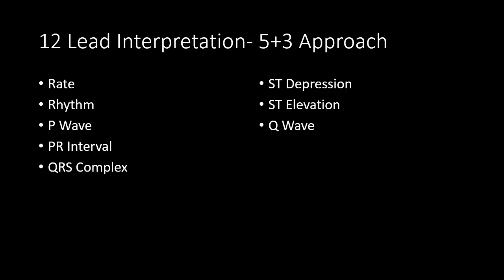Now, we do learn that you do see very small Q waves from time to time, but we're talking about pathological Q waves here. These are going to be very deep Q waves that have developed after you have experienced ST elevation and now you've moved into necrosis of the tissue. Now, sometimes this can be an old finding from an old MI. But in the presence of severe change and all that, we are certainly going to make sure that we pay particular attention to these three things: the 5+3 approach.